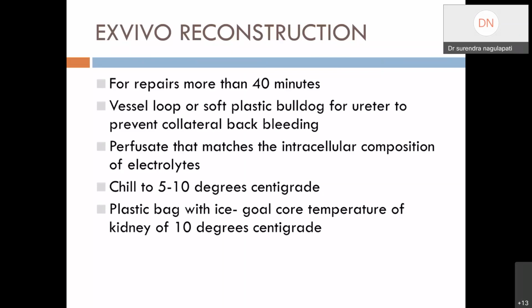Immediately after its removal from the renal fossa, the kidney is flushed with 300 to 500 ml of solution until the venous effluent is clear and all segments of the kidney have become blanched. As each anastomosis is completed, the kidney is perfused with an additional 100 to 200 ml of chilled solution.